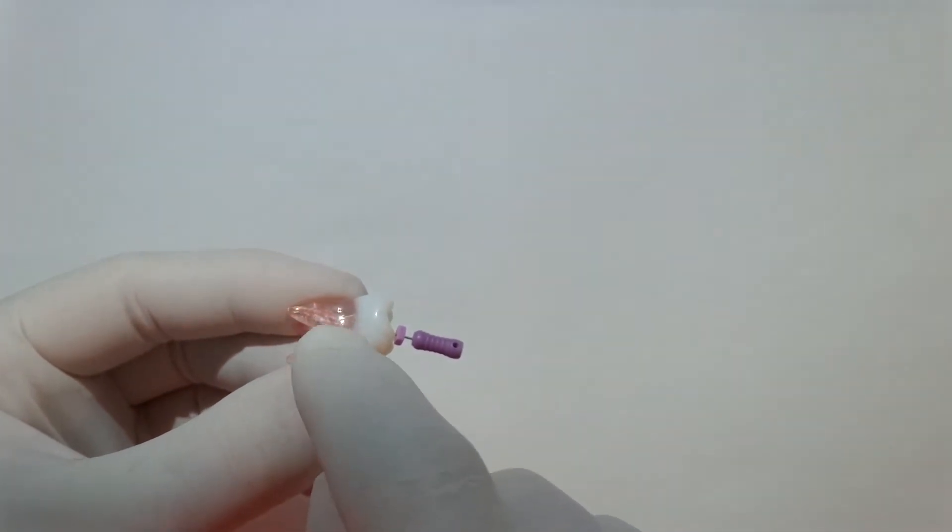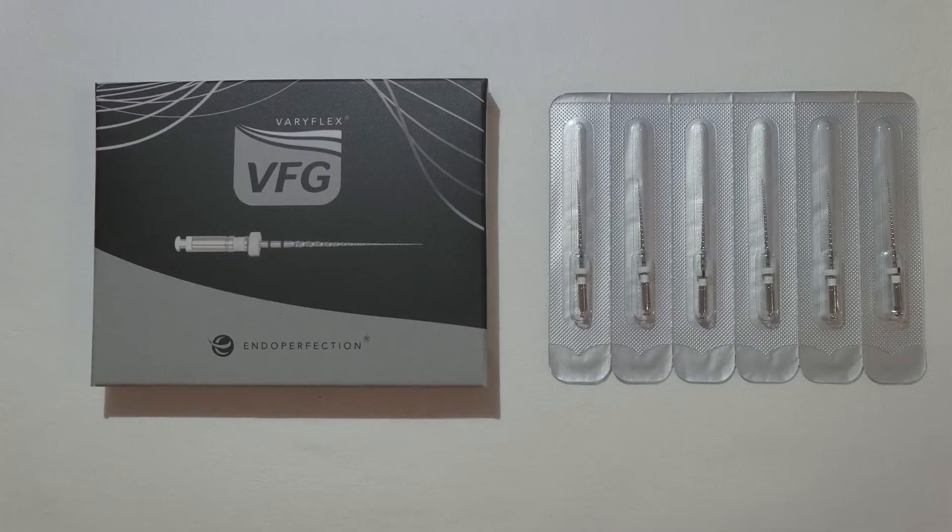Reference points: you can either use the palatal cusp here because the coronal curve skews it over towards the palatal, or you can use the mesiobuccal cusp, personal preference.